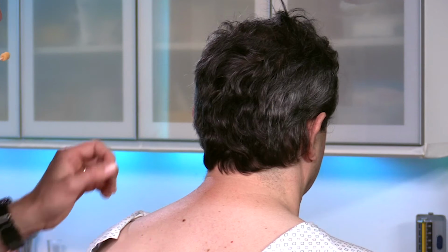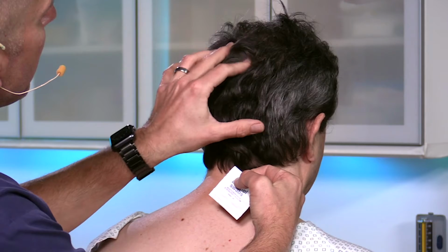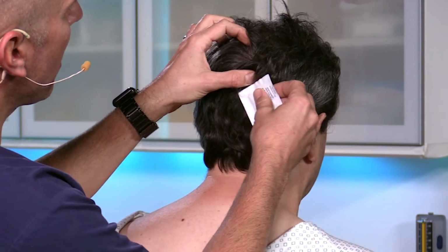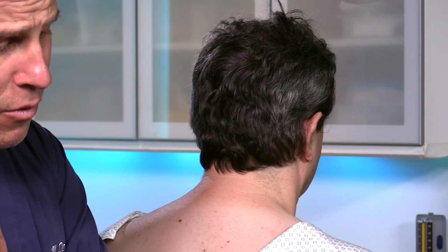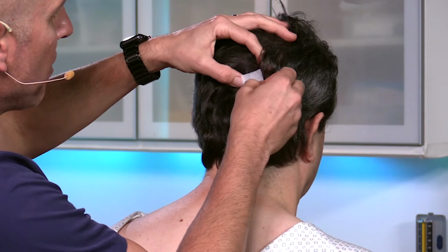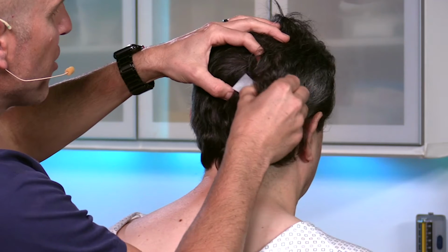So what I'll do is I'll just prep my area. I'll keep my finger on my mastoid process and the occipital protuberance, find where my nerve is coming out. I'll clean that area with my alcohol. Now, remember, the patient has a lot of hair here, so no biggie. Just spread it out and clean it up with your alcohol swab where you're going to inject.